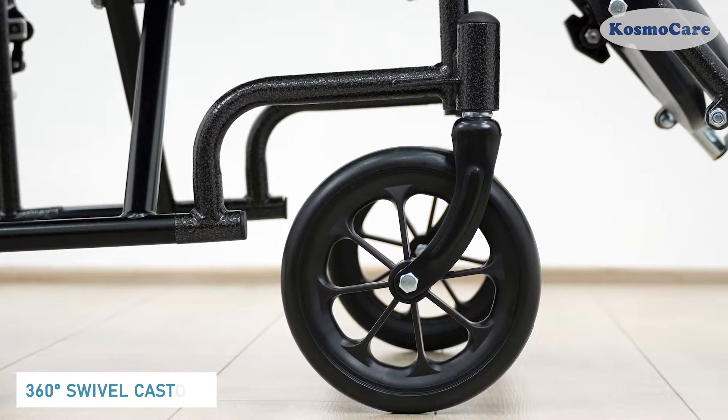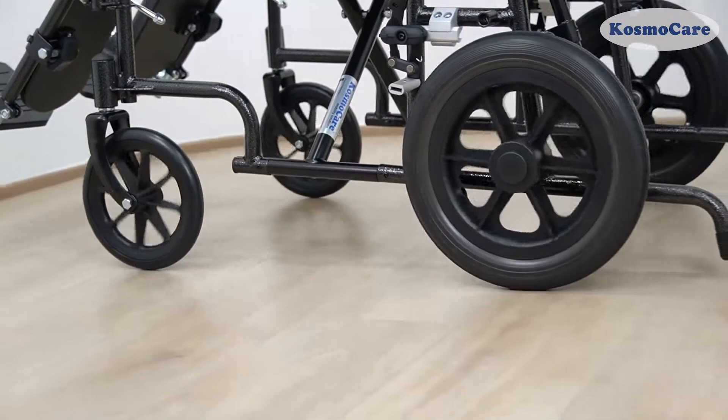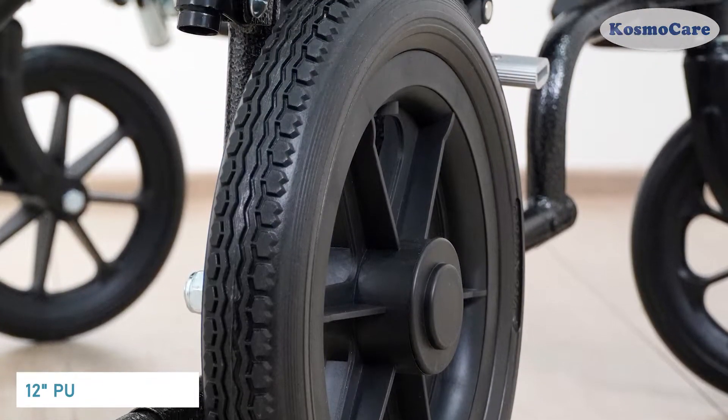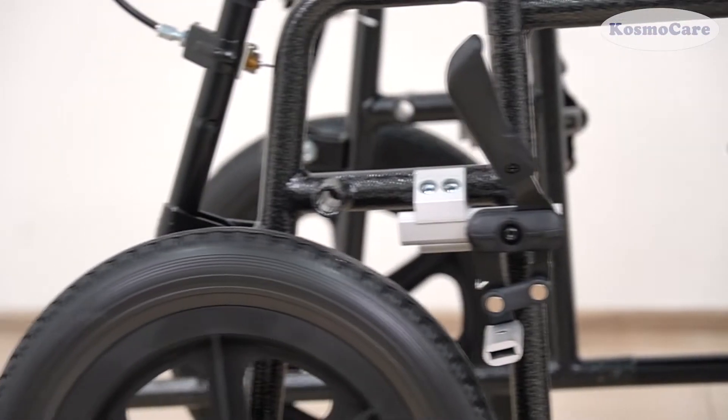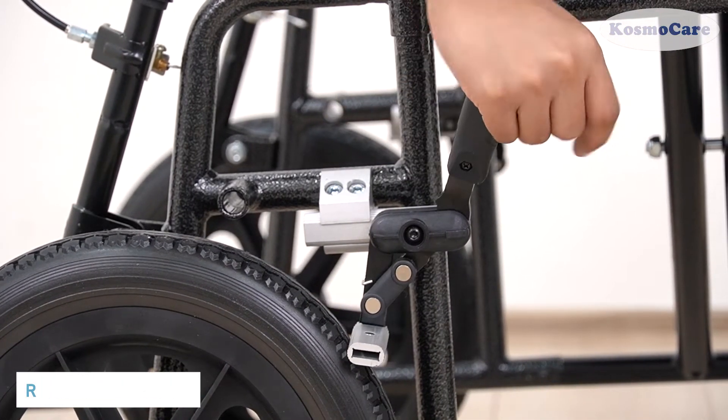Solid PVC front casters swivel 360 degrees to maneuver the wheelchair through tight spaces. 12-inch PU rear wheels ensure smooth maneuverability on rough and outdoor surfaces. And when at rest, the accessible wheel lock lever securely locks the wheels.